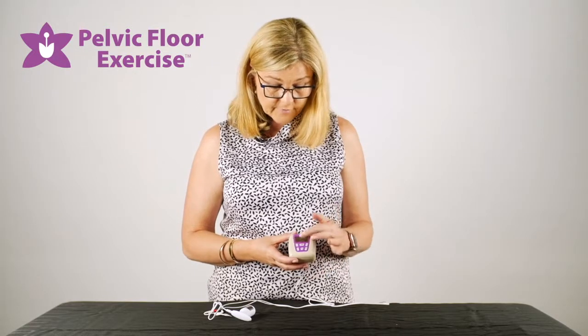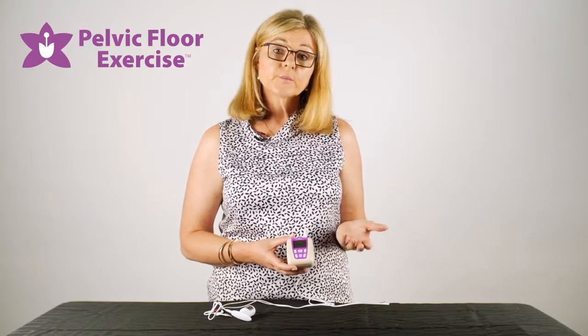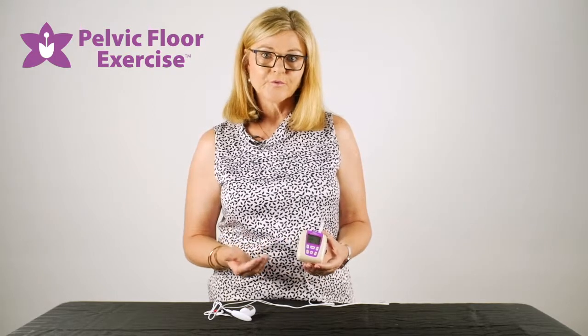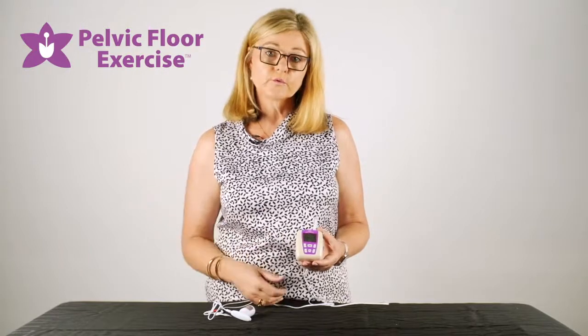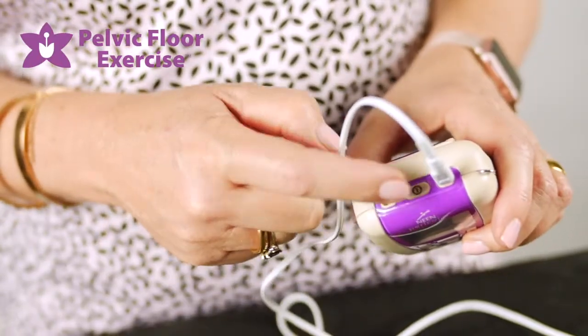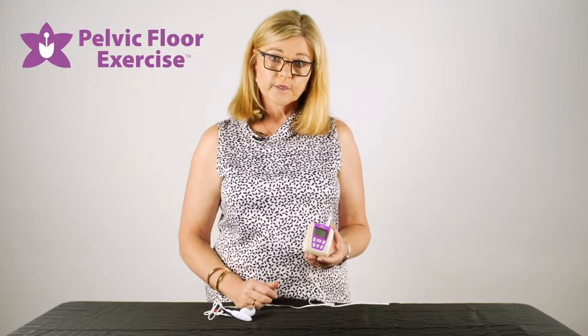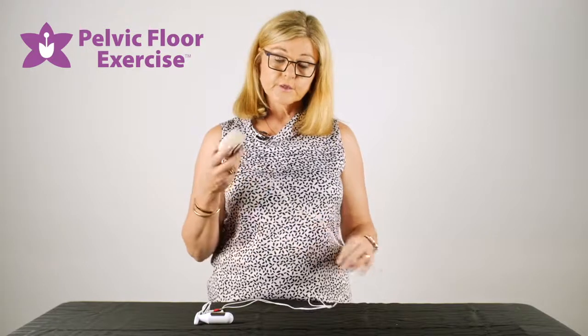Each of the programs has a timer which will run down and then the program will finish. You can stop your program at any stage — if the doorbell rings, or if you feel fatigued, you can build up to the full program. Simply press the on/off switch to turn the machine off, then remove your electrode, wash it, and store it for your next treatment.